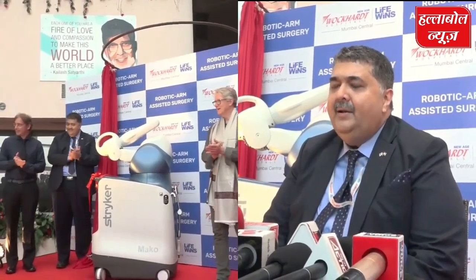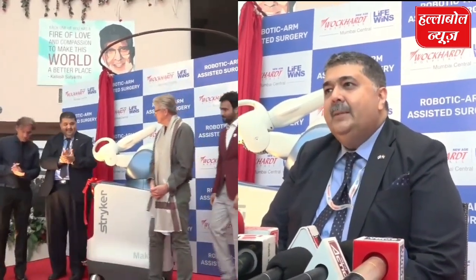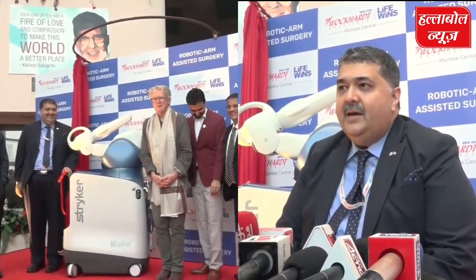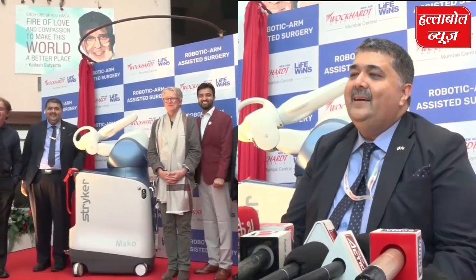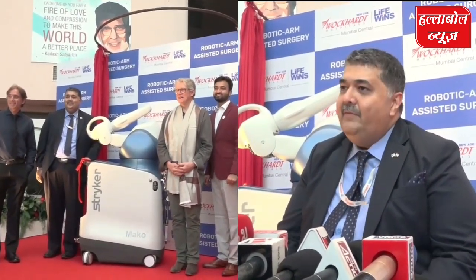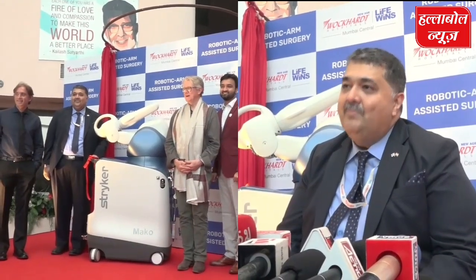they should be able to do a surgery in approximately 2 hours as compared to 3 hours. This will minimize the risk of extra anesthesia. It will make the OTs more efficient, and therefore our patients will be out much faster.